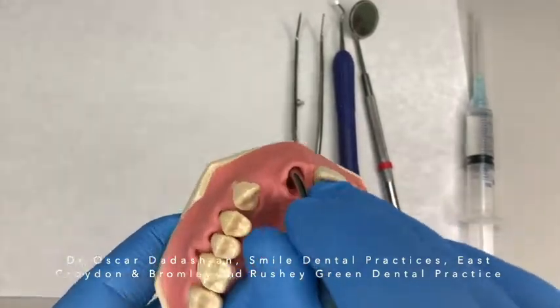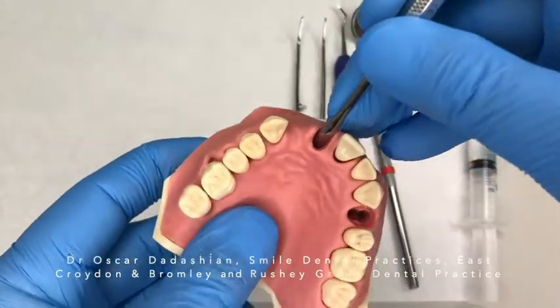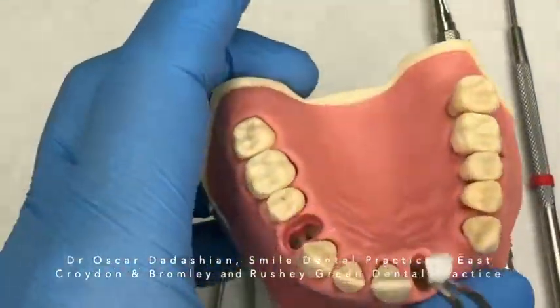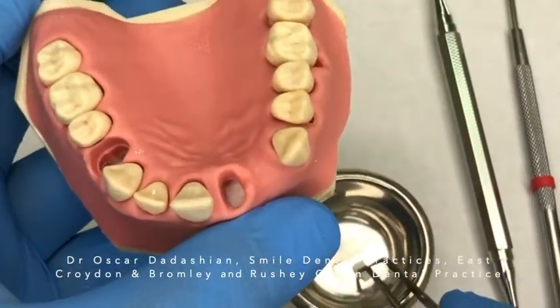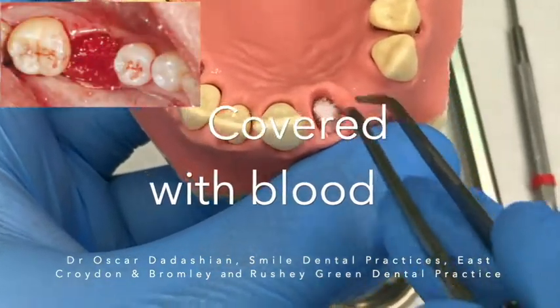I will cut the Bio-Oss collagen into smaller pieces. The sockets are filled up to the bony walls. I then make sure that the grafting material is covered with blood so that it's not dry.